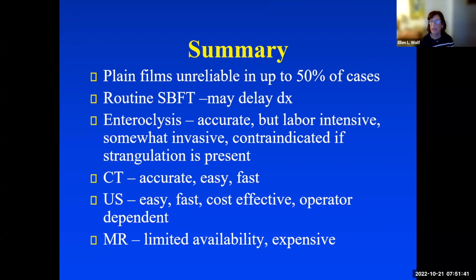If we see dilated loops of bowel, if we're doing a study for some other reason, we'll suggest it, and they'll generally go on to have a CT. So it's really done in cases that are suspected to have something else, not as a primary tool to diagnose small bowel obstruction where I work.